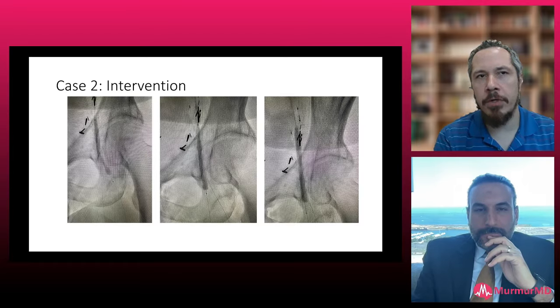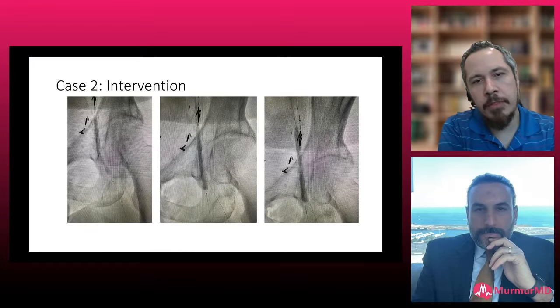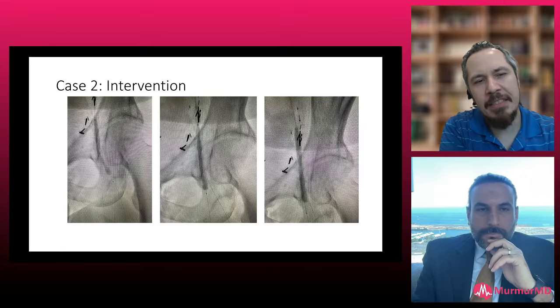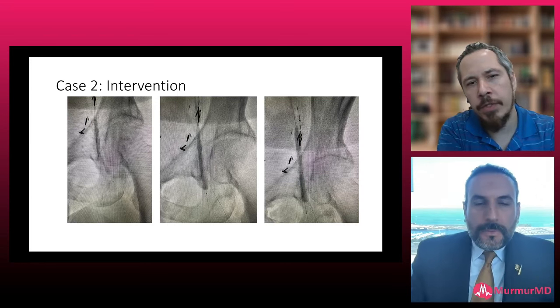Most important artery is the profunda. You gotta protect the profunda. You cannot tell me common femoral to SFA and the profunda shut down. So what you said, yeah, went radial. We used a 119 radial to peripheral sheath, 6 French. We put two wires.